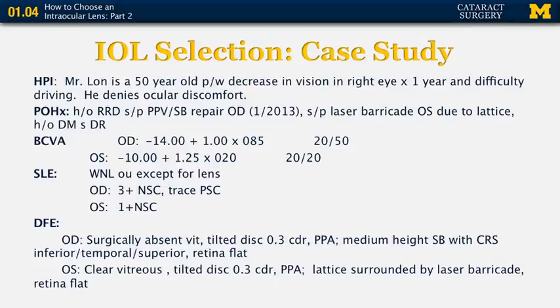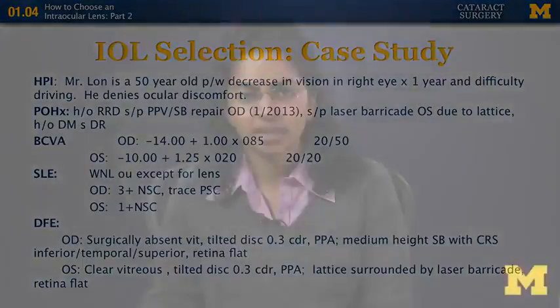Or perhaps it's the nuclear sclerotic cataract that's created a myopic shift. Or finally, maybe it's a really true anatomic difference, in which case we might think, okay, the vision potential might be limited in that right eye, not only from the retinal detachment, but also potentially from amblyopia from having such a significant difference in an axial length. These can all be quite helpful in informing the patient for kind of expectations post-operatively.